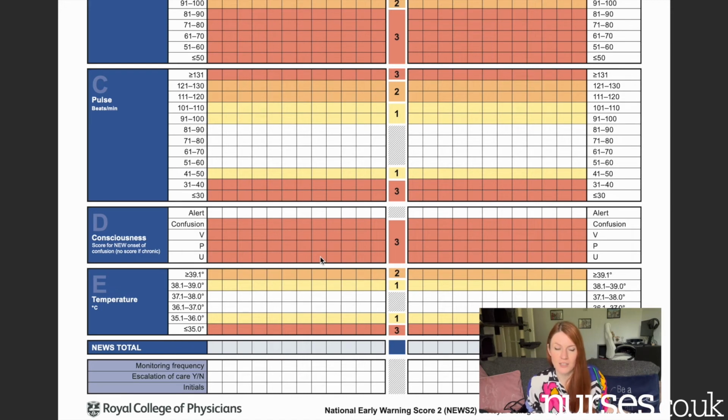They're scoring 9 now. And then their temperature's 35. Oh my gosh, that is a 12. What am I going to do with this patient? So the NEWS total at the bottom here is a 12. So you put your score, the 12, in the bottom, and then you're going to look. Usually there's another side to your observations.